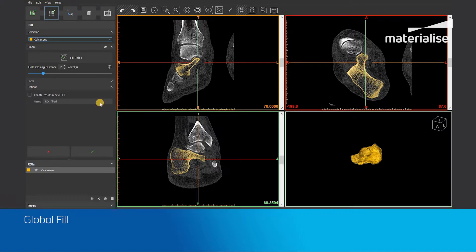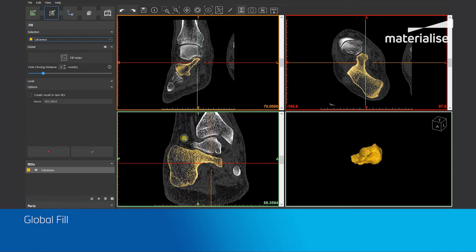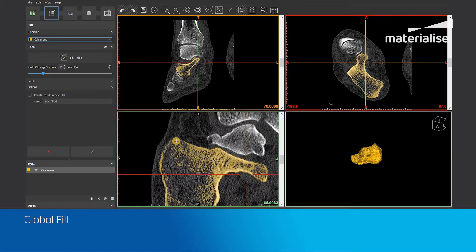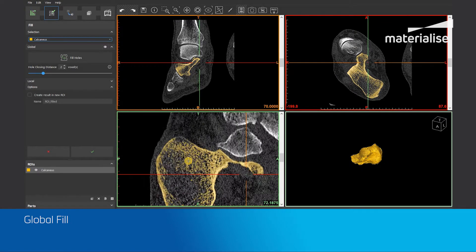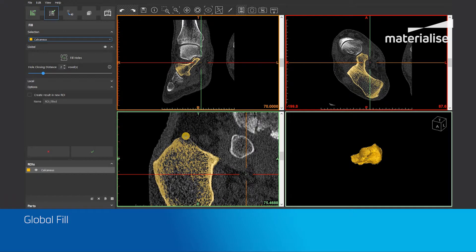First we will use the global fill to fill up the entire region of interest. Here you will first have to set a hole closing distance. With this parameter it's important to look at the outer border of your region of interest and measure the size of leakage present. In this case there are small and big leaks so we will need to find the balance so we don't lose detail in certain areas. We will now use value 2 and click on the fill holes button to start the algorithm.